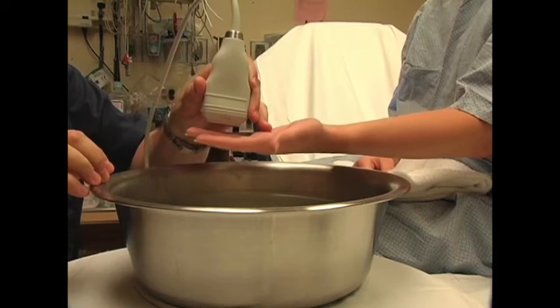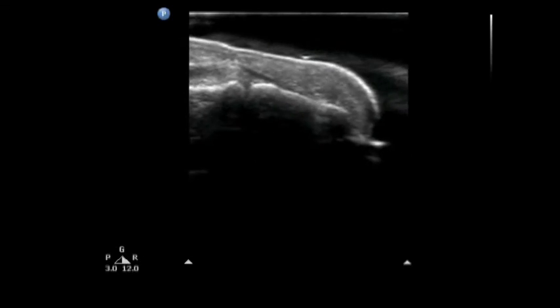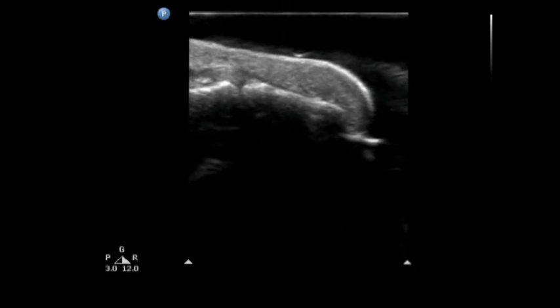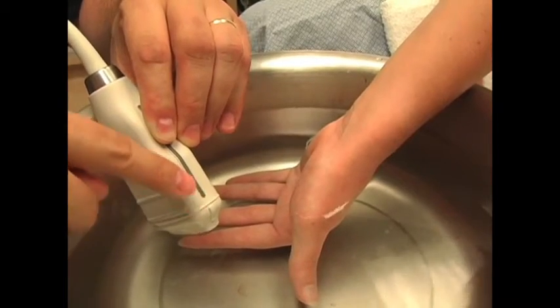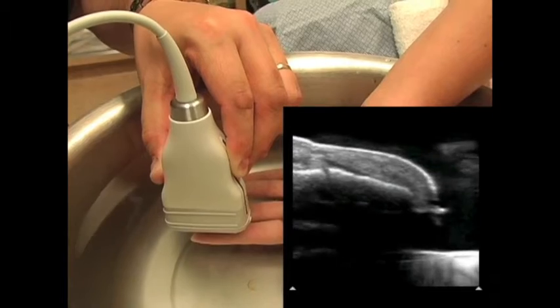Dr. Haggerty is now lowering the hand and the ultrasound transducer into the water. And on the ultrasound screen, you can see the nice black sonographic window created by our water bath. The transducer indicator is placed towards the patient's head so that the fingertip is seen on the right side of the screen.